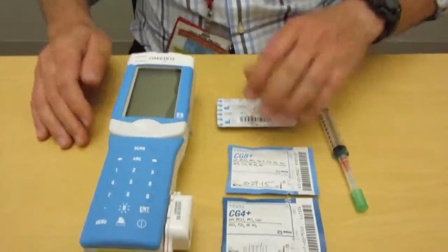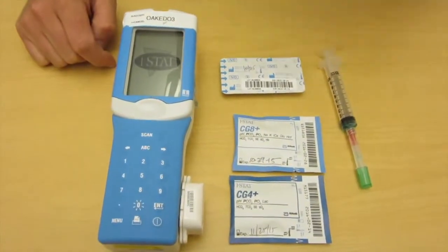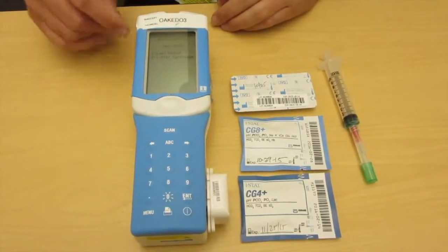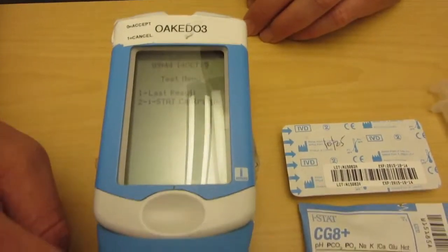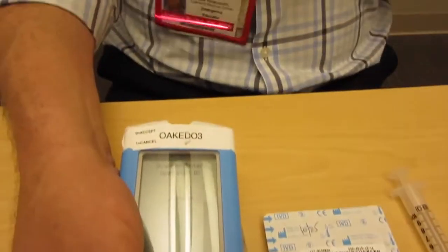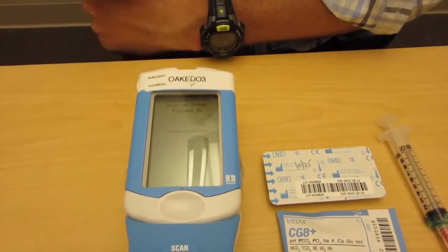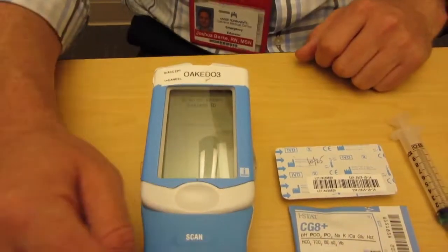To turn on the iStat, press your power button. These are going to be bleached between uses for patients so we're not transmitting infectious diseases. You have two options: last result or iStat cartridge. We're pretty much always going to press number two for iStat cartridge. Then we're going to scan our operator ID, and then enter our patient number. If a patient has a wristband, you would scan the barcode on the wristband, but I'm going to enter in our John Doe number.